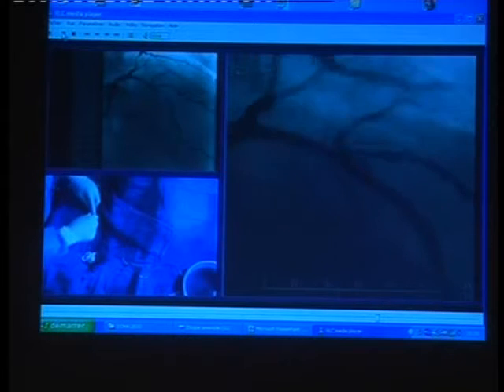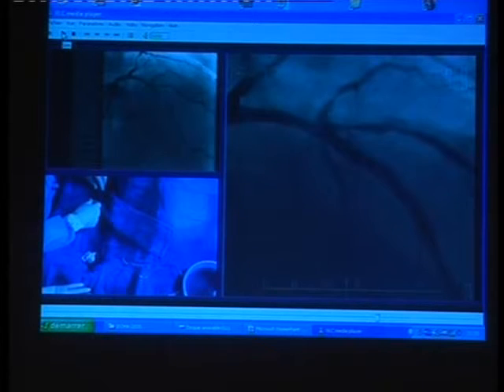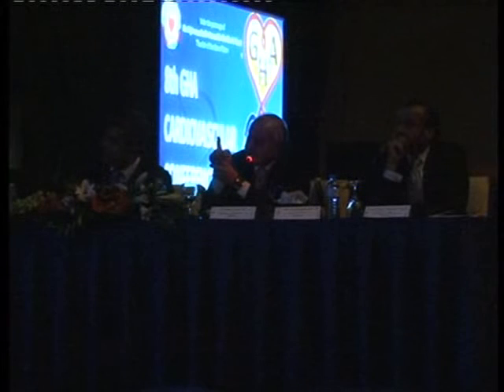Can I ask you a question regarding the bifurcation? If you believe that there is plaque shift, and we don't know what is going on with this diagonal, do you do recrossing first, before doing high pressure inflation in the proximal part of the stent? Because if you do high pressure inflation, it will be impossible to pass another wire to the diagonal to recross the wire. What do you think about this?